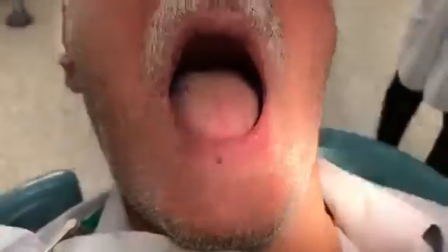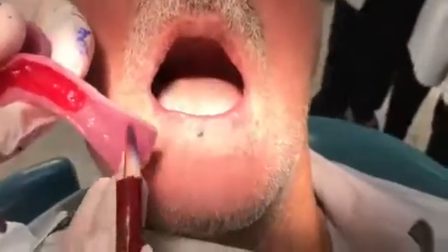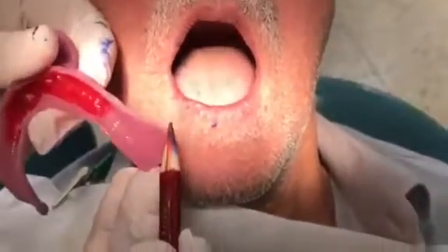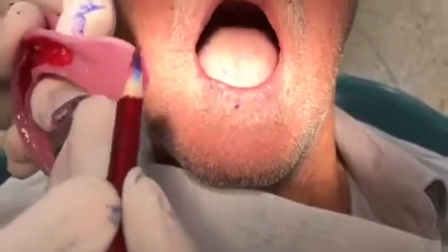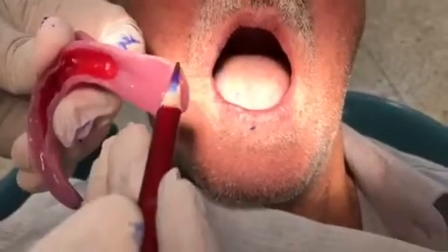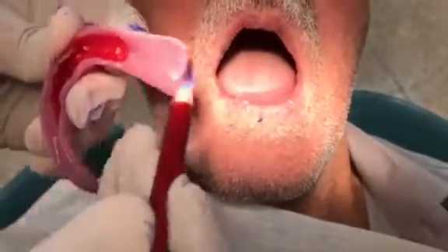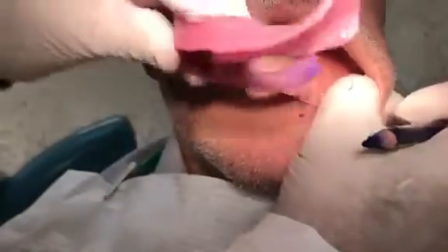Another question we face from our students is about this area, which is the distal buccal of the lower. This angle here is where we have the masseteric plane. If the masseter is not very prominent, it's like a plane. If it's prominent, sometimes it even comes as a notch because the masseter is very heavy there. It depends on the attachment of the masseter.